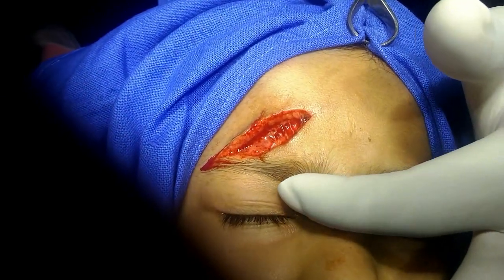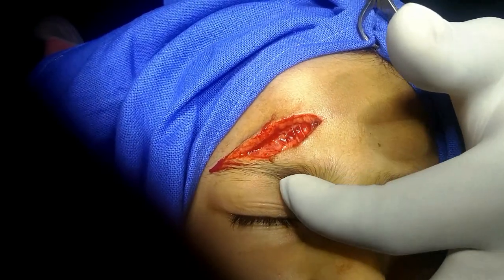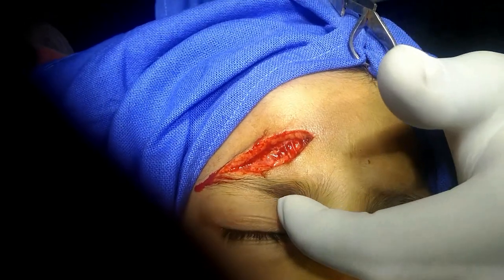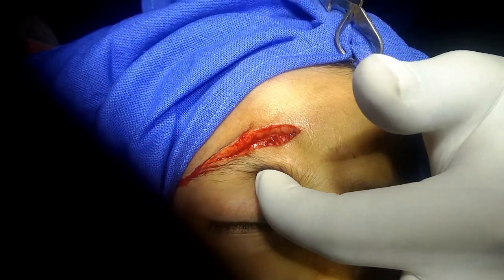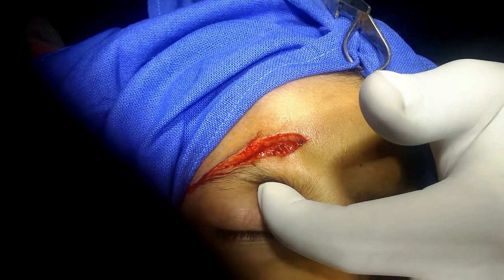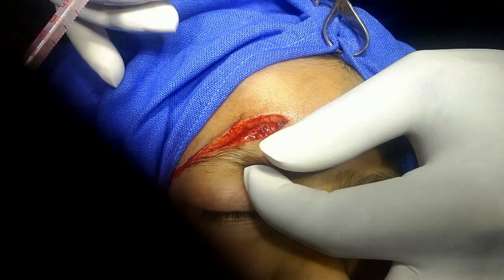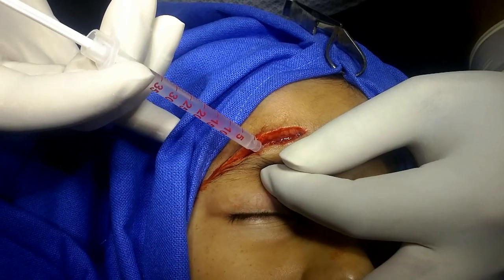The technique for the supraorbital block is to place the tip of the index finger and palpate the supraorbital margin. When we roll the tip of the left index finger, we can palpate a small notch. The supraorbital foramen — or notch — can be felt here, and this is where you insert your needle.